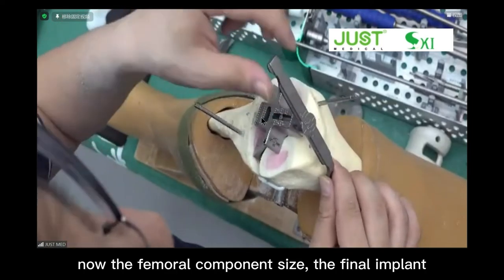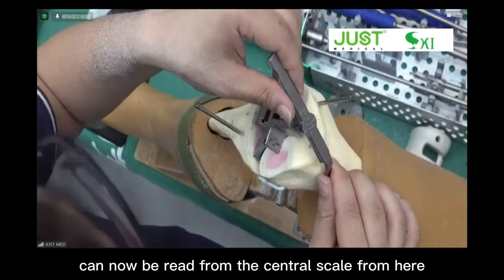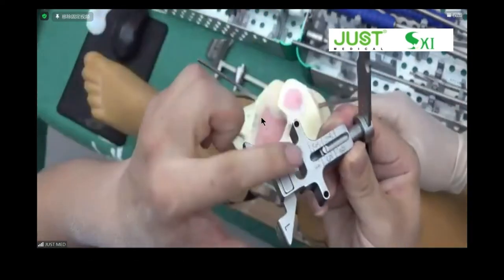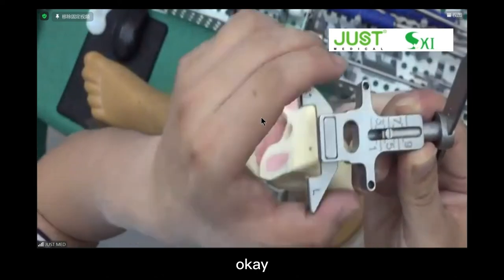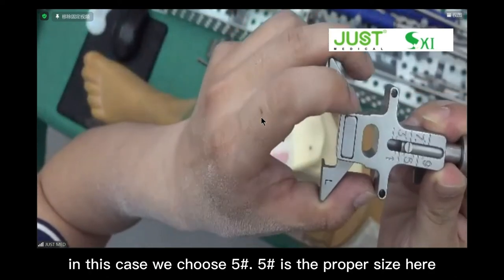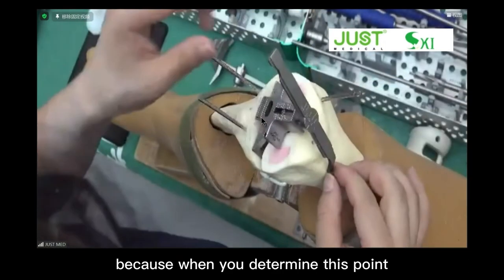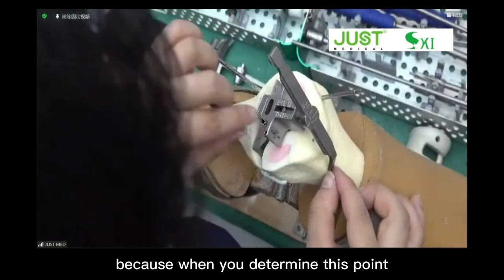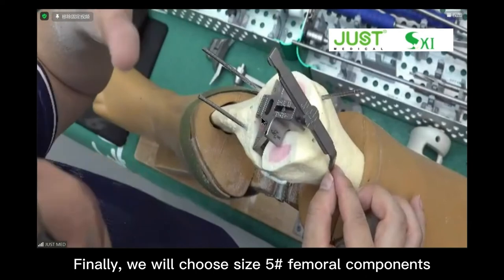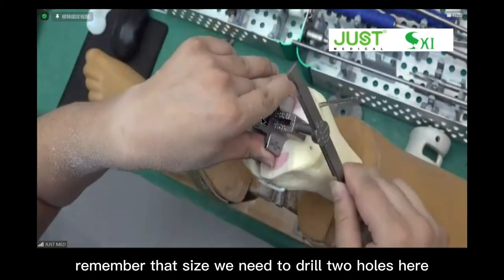Now the femoral component size, the final implant, can be read from the central scale, from here. I'll show you. In this case, we choose 5. 5 is the proper size here, because when you determine this point, you can read from here, it's 5. Finally, we will choose a size 5 femoral component. Remember that size. We need to drill 2 holes here.